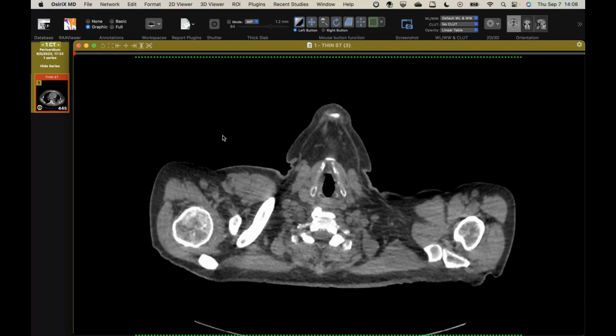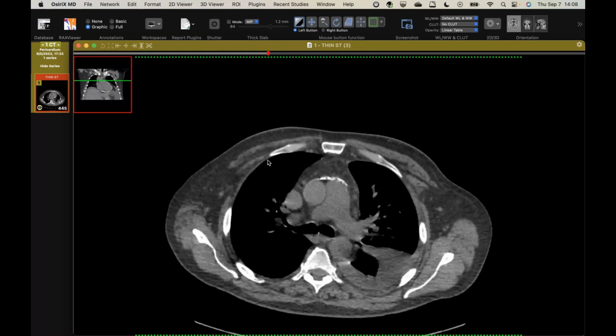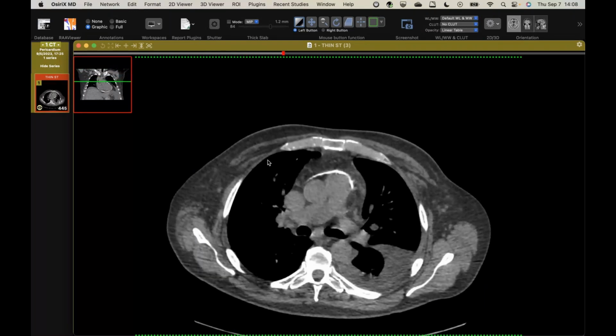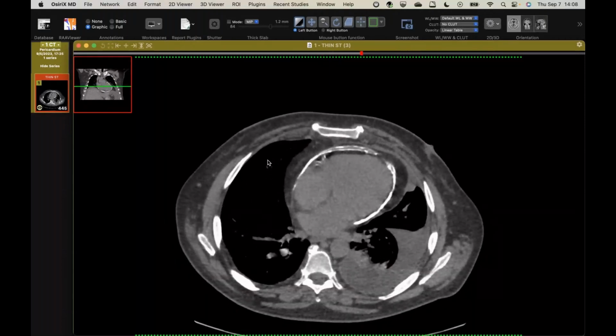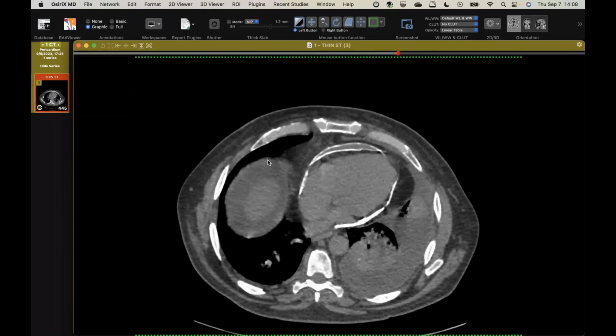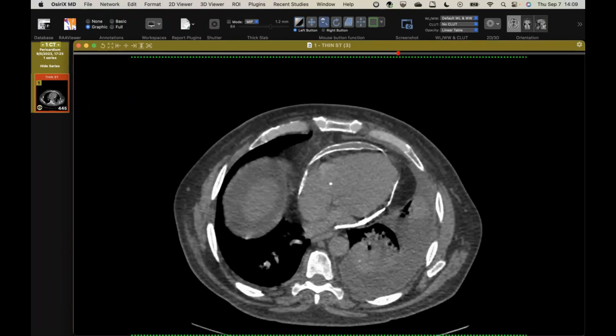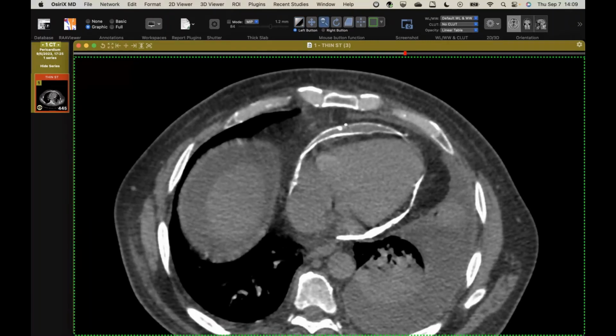My colleague Mark shared this case with me. It's just this patient had presented with shortness of breath and swollen lower extremities. And this is one of the prettiest cases of calcific constrictive pericarditis I've seen. Also, one of the more exuberant ones. I don't think I've seen one this bad in a long time. And you can see there's even milk of calcium, presumably in the pericardial space.